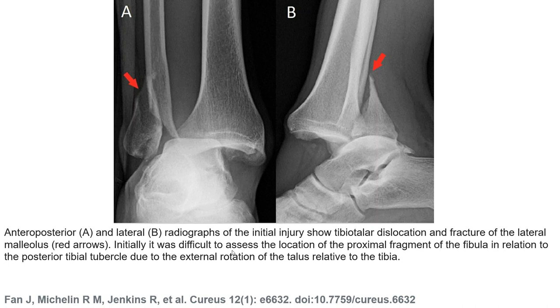This is the second example of the Bosworth fracture. The image on the left is the AP view, and the image on the right side is the lateral view, showing tibiofibular dislocation and fracture of the lateral malleolus.